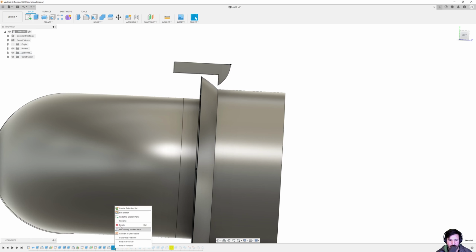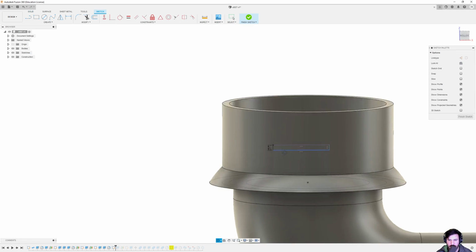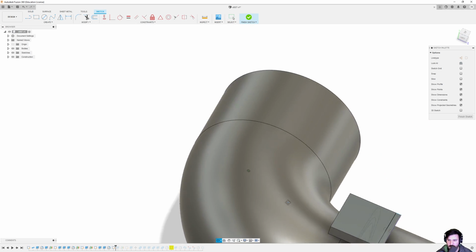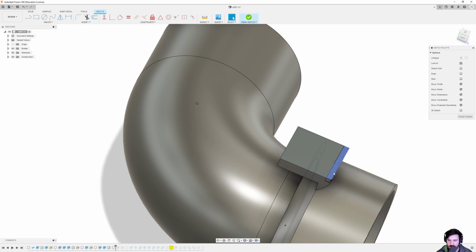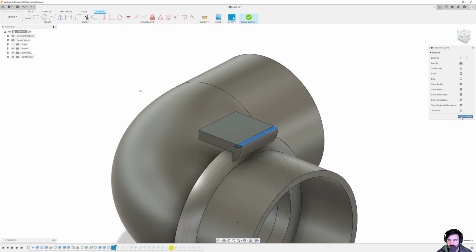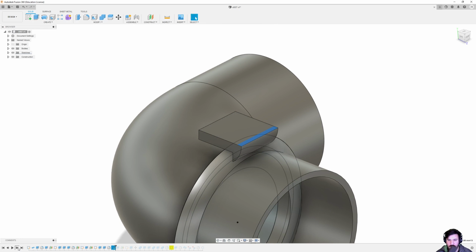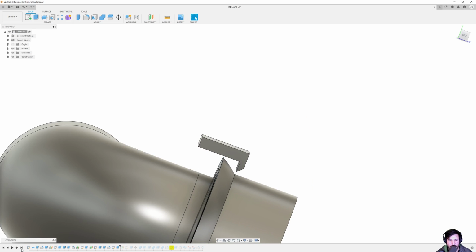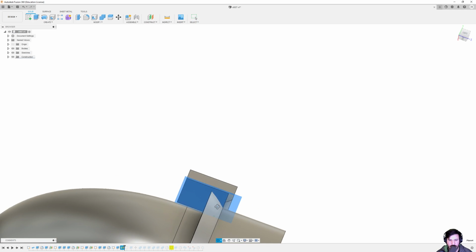Next, I made another sketch. Let's see. Looks like I made it on the underside of the upper side of this right here. This right there. You can see I made that sketch right there essentially. And what I did then is I trimmed off some of the front just to make it a little less bulky. And then from there, I made another offset plane on the underside right here.